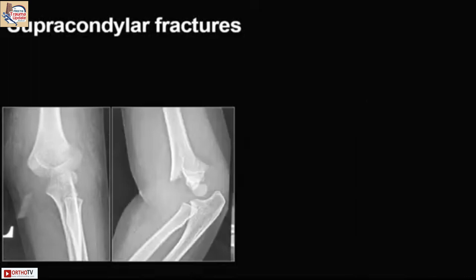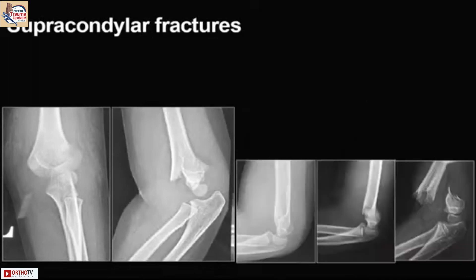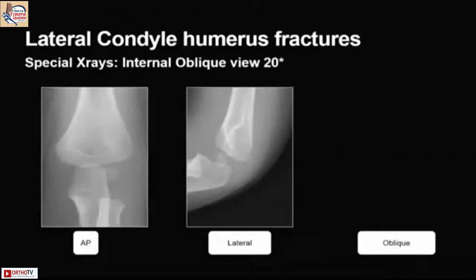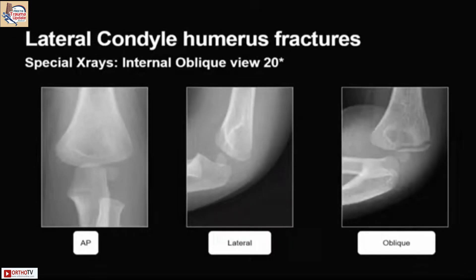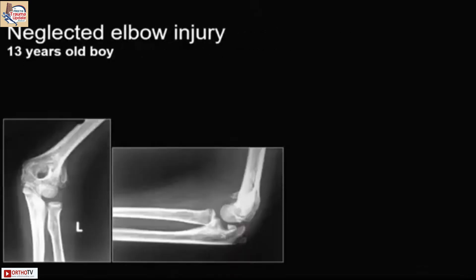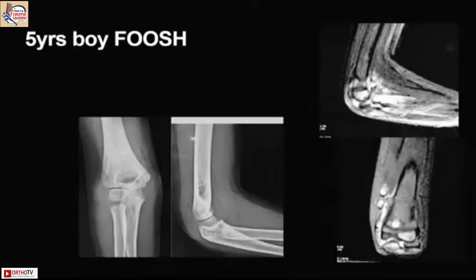For supracondylar fractures, one view is not enough. On the lateral you may see many things that can change management from conservative to surgical — that's the anterior humeral line. For lateral condyle fractures, you need an internal oblique view. This is an incarcerated medial epicondyle fracture into the joint, which was thought to be a dislocation and reduced, but after four weeks the child came back — with the radial head lying 180 degrees upside down, almost outside the joint. There is a faint thing overlapping the olecranon on x-ray.